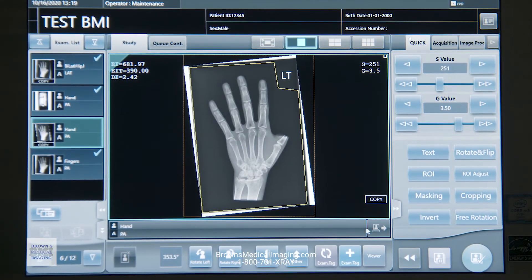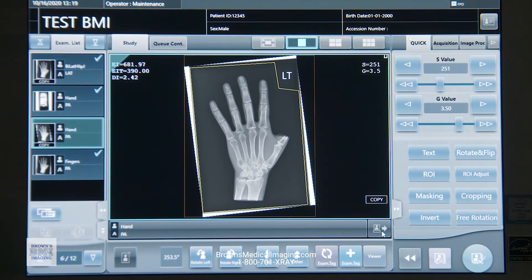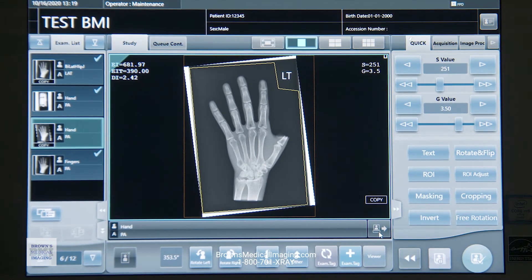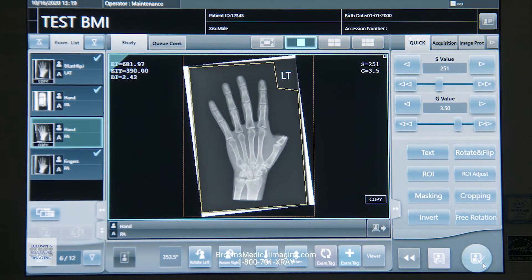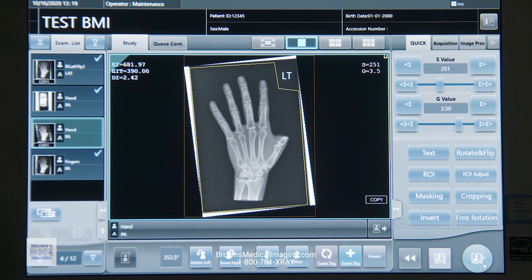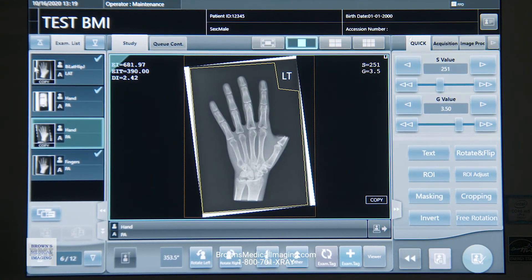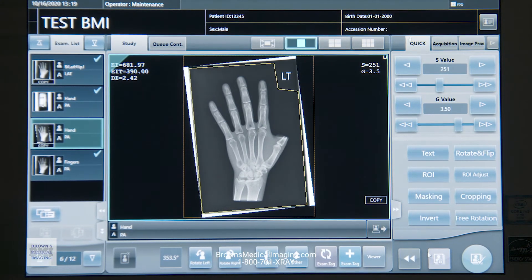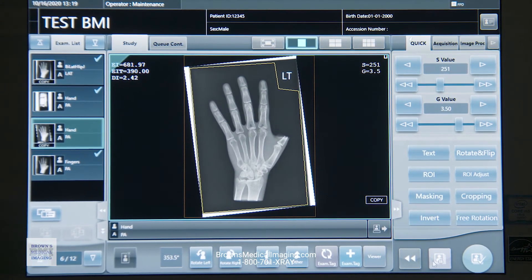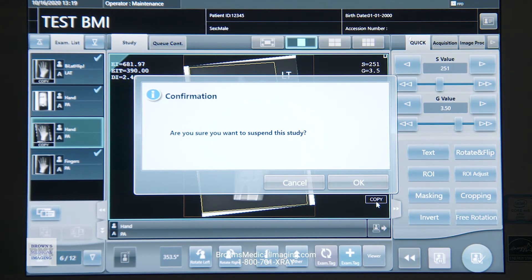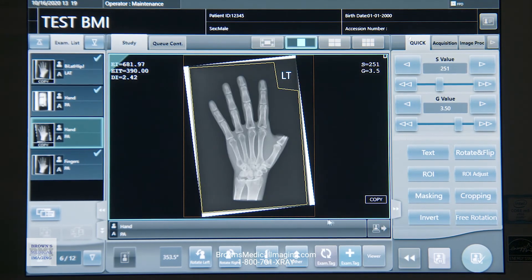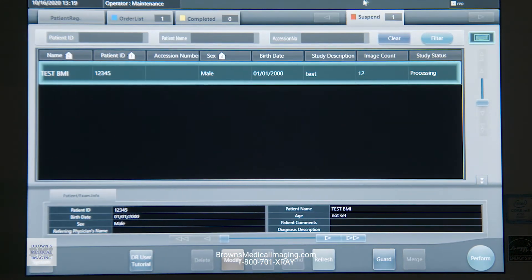Over here on the right-hand side, bottom right corner of your image, you've got a send button. That's just going to send this one image, or I can send all — everything from this study, and then everything from my multiple studies if I want. The purple button down here with the little pause symbol is going to suspend the study, which throws it over into the suspended tab.